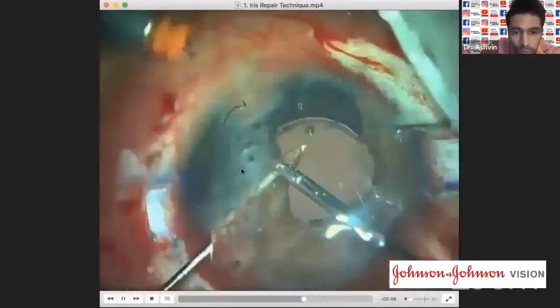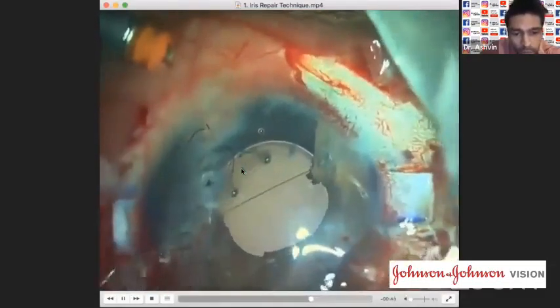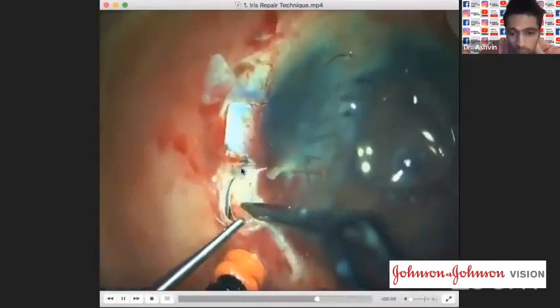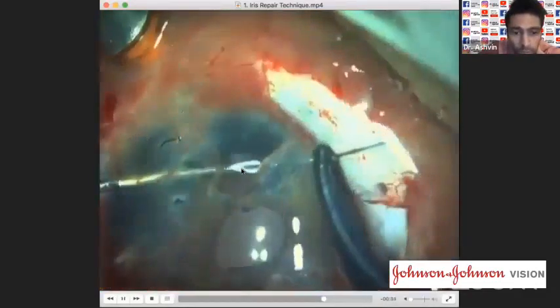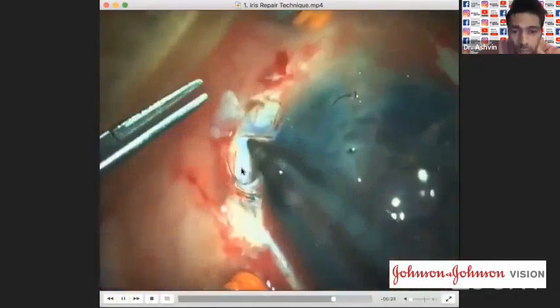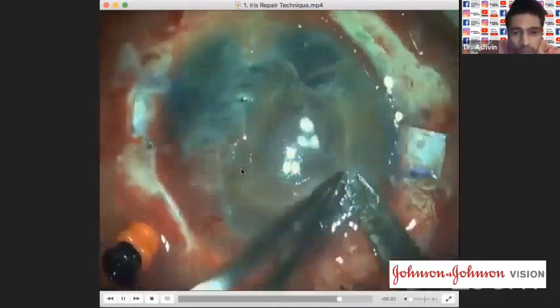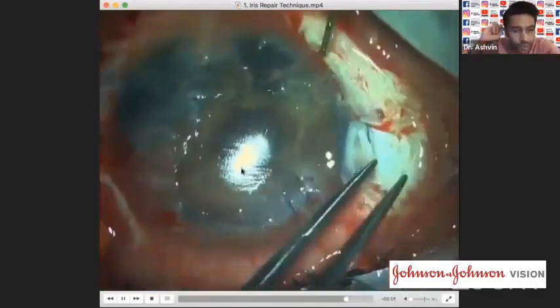Now, this was a very important step which a lot of us might miss. If I did this without doing the second hangback, I would actually lose the traction which I would have had. So first I'm doing a hangback, and now a pupilloplasty repair. The second one, my heart was in my mouth, but I still had to proceed and attempt to close that gaping optic which I could see of the IOL. Fortunately for me, in this case, I was lucky to get away with this. I did not have to do a PK at that point of time.